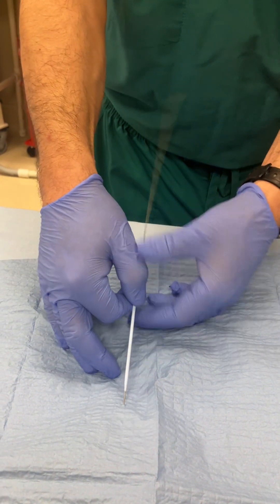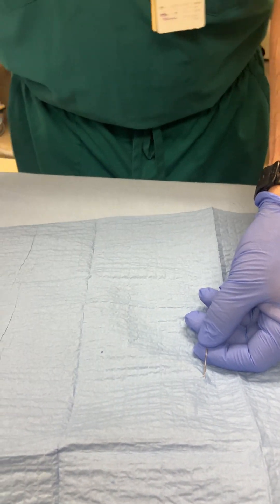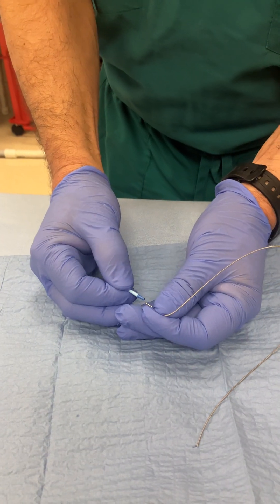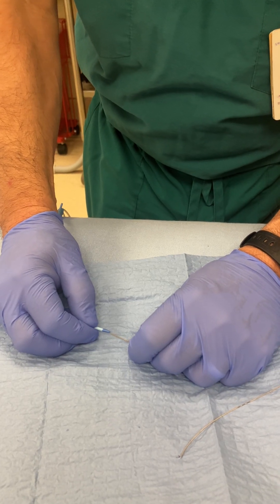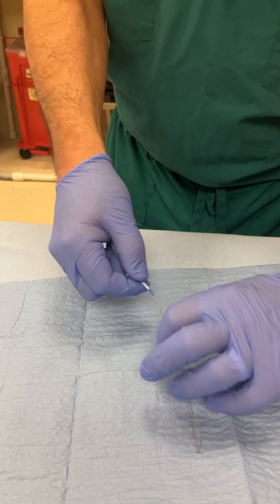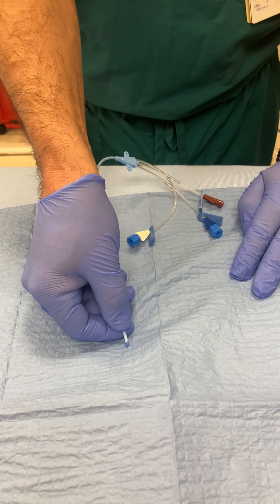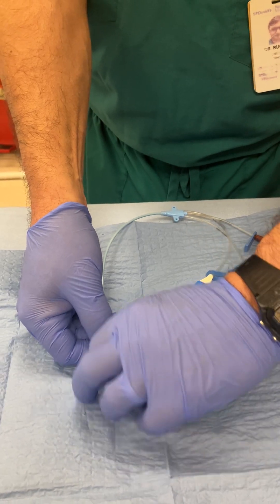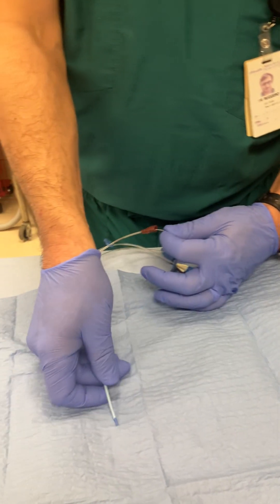Now it's dilated. I'm going to remove the dilator. You're going to have a little pool of blood because you've made a larger opening — now it's time to advance the catheter. When the wire is accidentally pushed into the patient's body, this is usually the step where that happens, because instead of waiting until you have control of the wire, some people start to advance the catheter and end up pushing the wire in. So I'm not going to advance this catheter until I have control of the wire. I bring it back and now I have control of the wire, so I can advance the catheter.